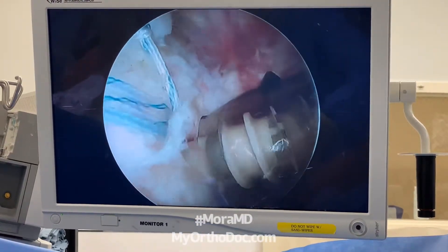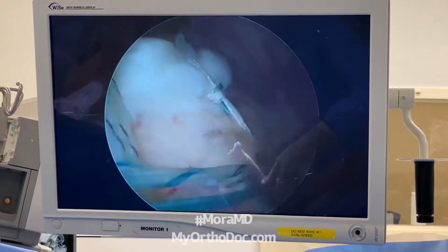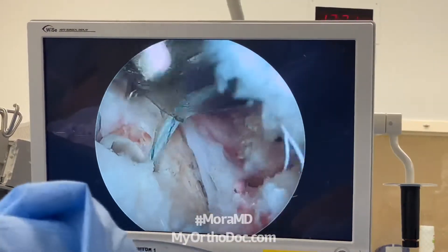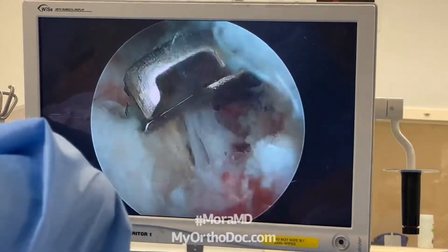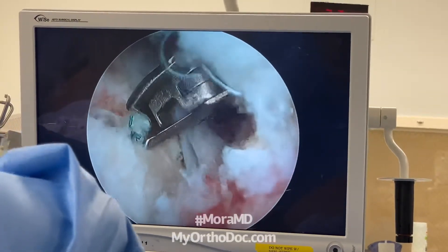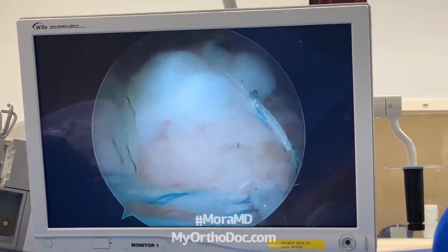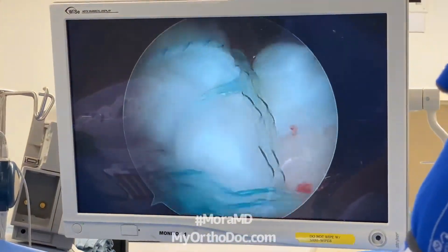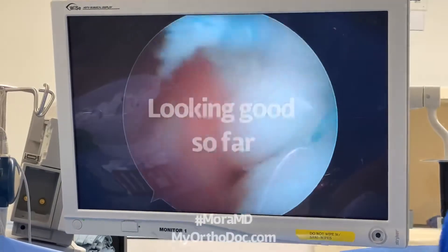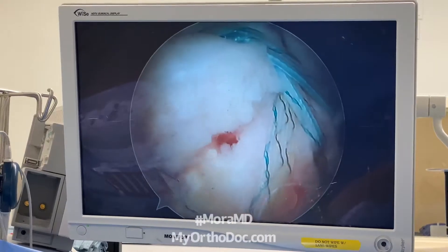My goal is to compress the edge of this tendon — this rotator cuff tendon — to compress that edge right onto the bleeding bone. Let me do the final cutting of these sutures here. Boom, boom — it's just a little cutter like a fingernail cutter. Great, gorgeous. Now you can see there's good compression at the edge.